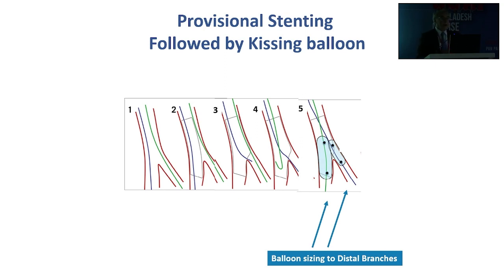So if there was plaque in there, and you balloon that plaque, and we know the mechanism of acute coronary syndrome, so what is an acute coronary syndrome? It's a plaque that breaks on its own, and it produces an acute thrombosis. Well, you are fracturing a plaque here. There is no more aggressive plaque rupture than fracturing the plaque with the balloon. So this probably is not mandatory to do.